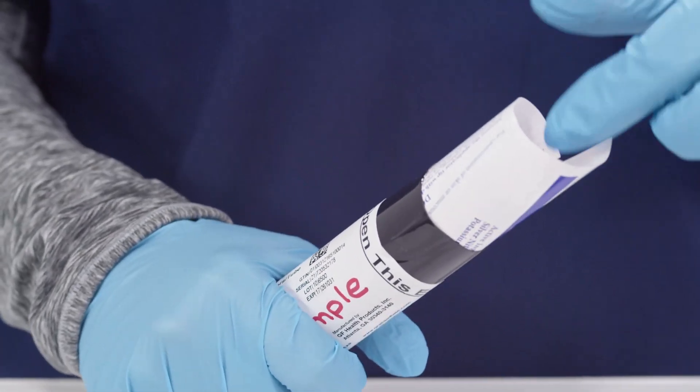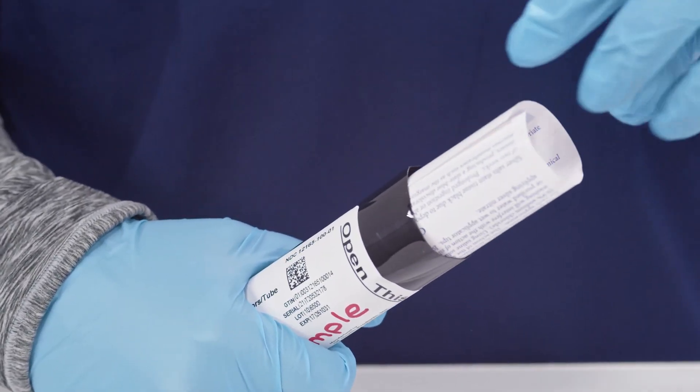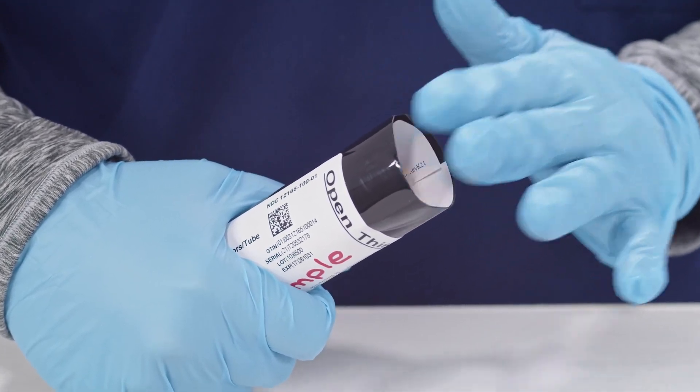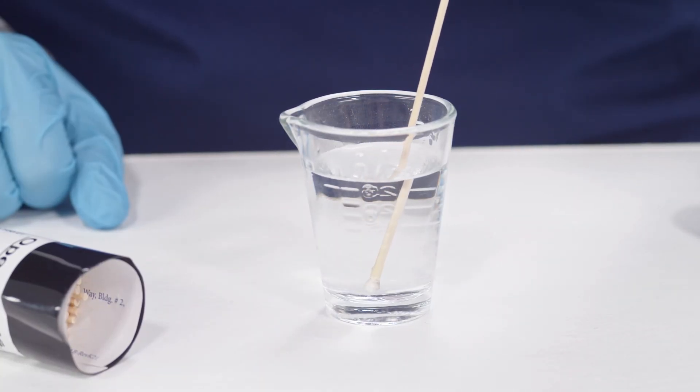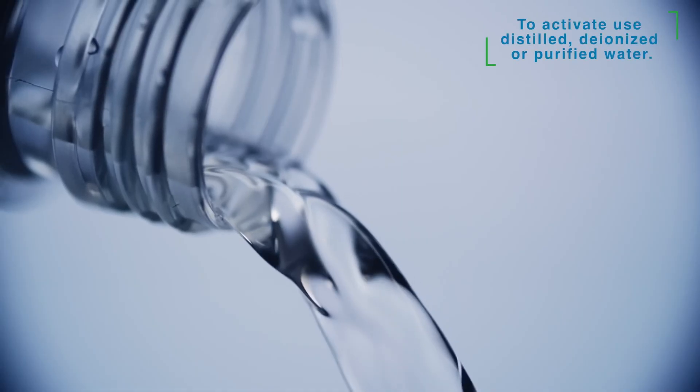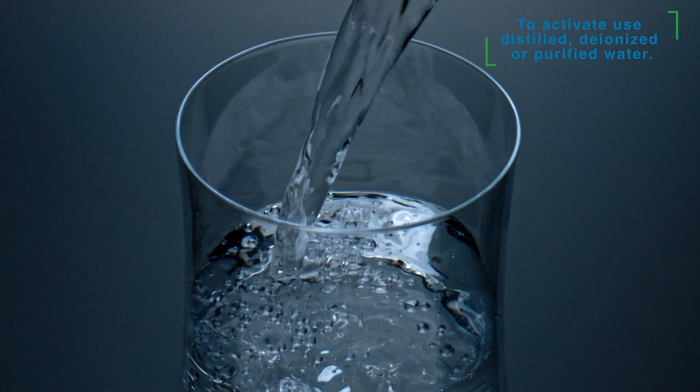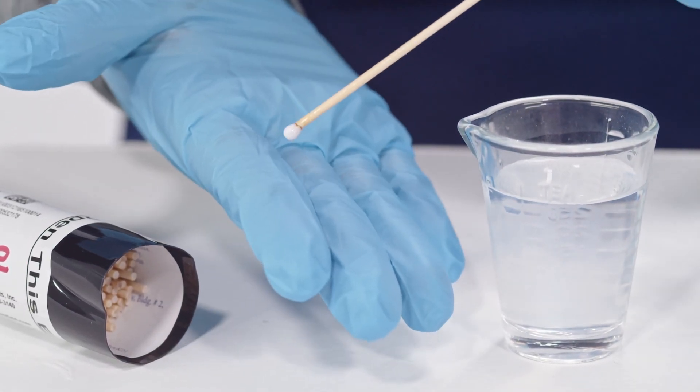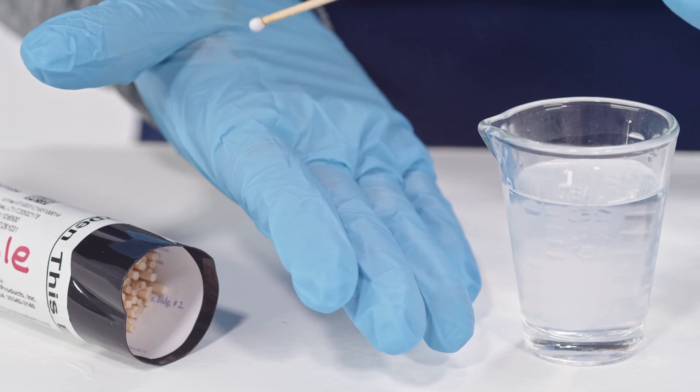Instructions can be found along the inside wall with the applicators in the tube. Moisten the applicator tip to activate silver nitrate. Only use distilled, deionized, or purified water to wet applicator tips. Once it's wet, the medication is activated and can be applied to the affected area.